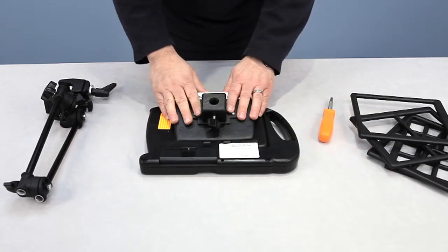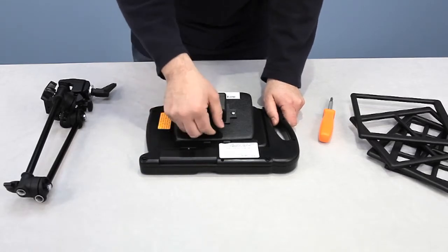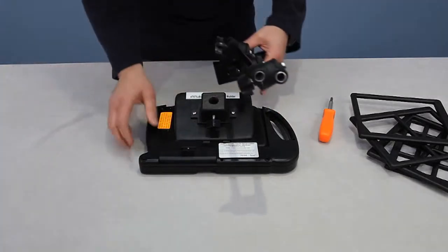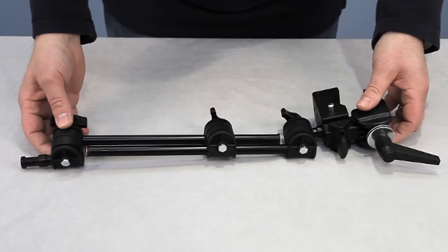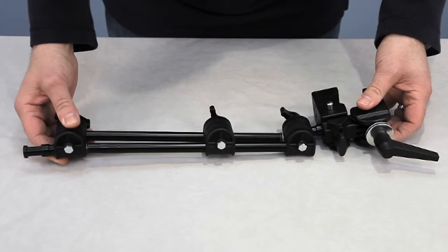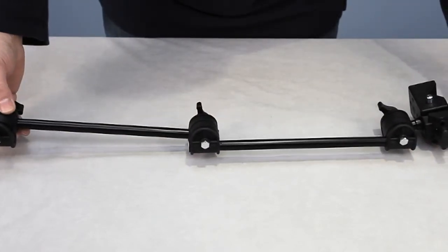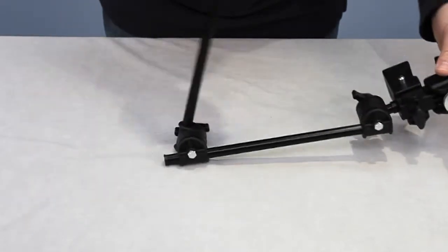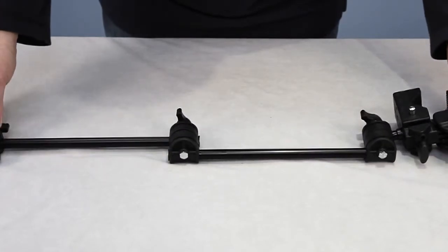Now that we have the mounting bracket in place on the back of the unit, this is your set knob, which locks into your mounting arm. This mounting arm is our light-duty magic arm, and it'll extend down as low as about 12 to 12½ inches, and it'll extend out to 24 inches. You have full adjustability — you can swivel and pivot this in almost any orientation.